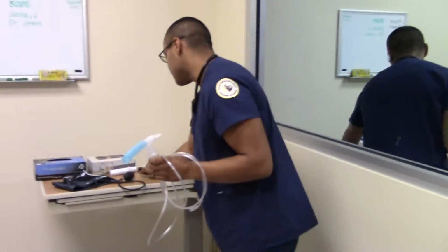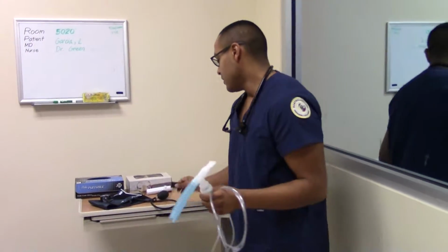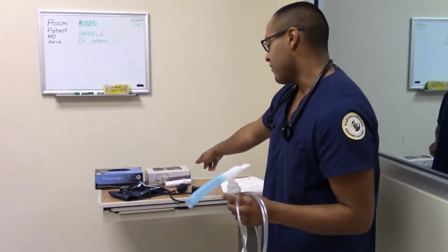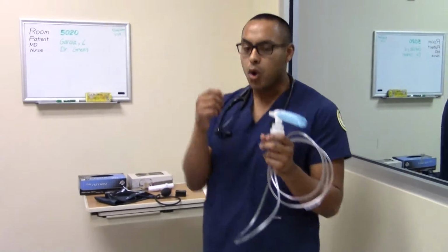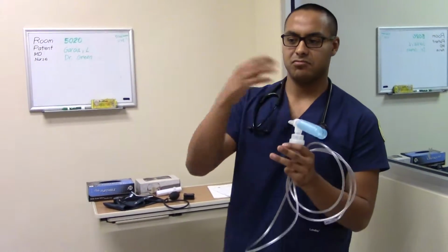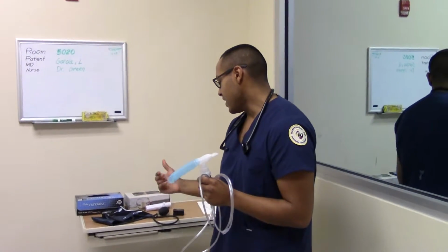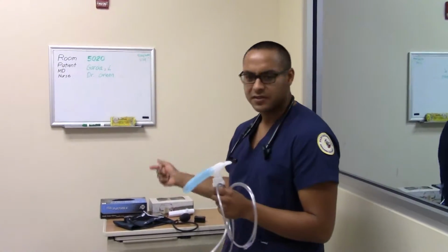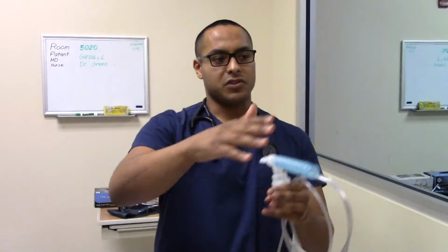Also, I need the pulse oximeter, for oxygen saturation, and a blood pressure cuff, and a peak flow meter, which helps read how strong the patient's expiratory rate is, and gloves and all that kind of stuff. Okay, all right, so that's the equipment, and now you go to the patient's chart.